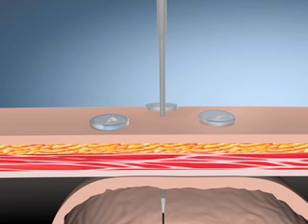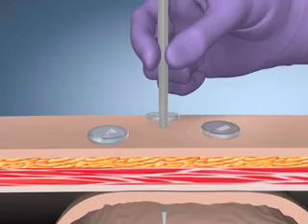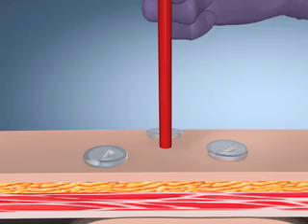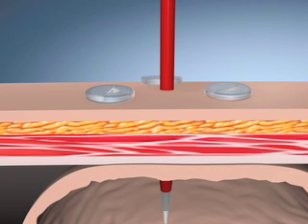While holding the serial dilator stationary, grasp the next dilator sleeve and with a clockwise-counterclockwise twisting motion, advance the next dilator into the stoma tract. Slide the segment forward until a physical stop is felt. Advance the red color-coded sleeve through the stoma tract and into the stomach. Moisten the tip of the stoma measuring device with water-soluble lubricant. Remove the dilator, leaving the guide wire in place and place on a clean surface.